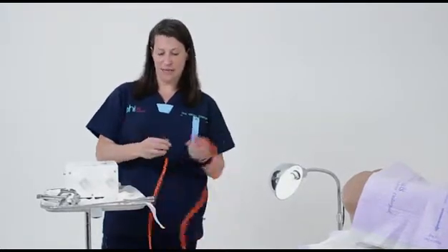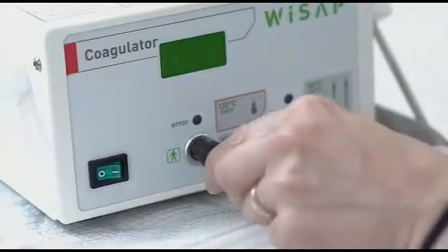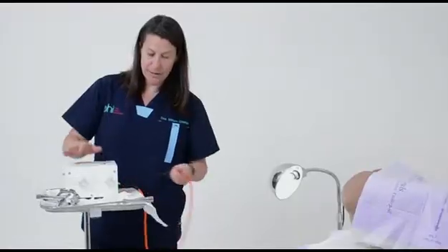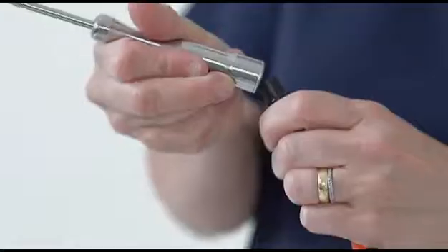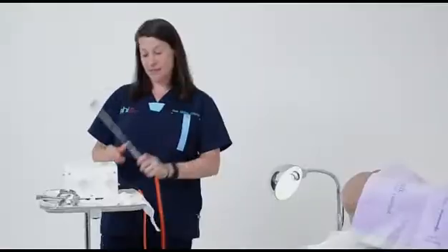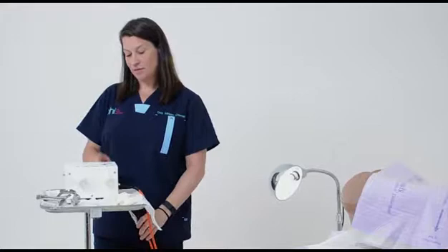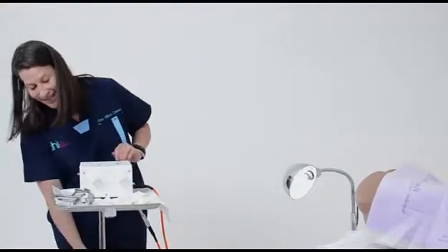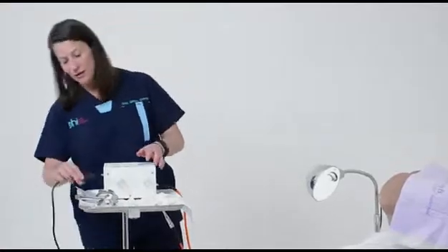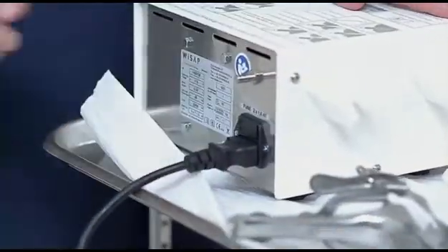I'm just going to show you how to set up the machine — it's really easy. There's a cord that connects to the front and to the probe. You put it on really simply, and then the device fits in the plastic thing on the side, and then there's a black cord.